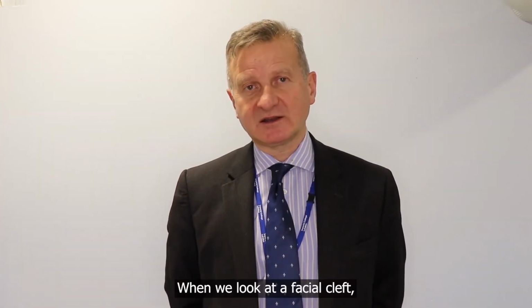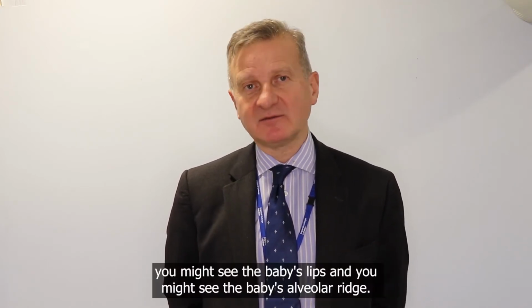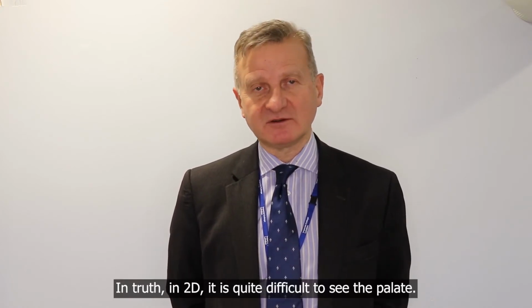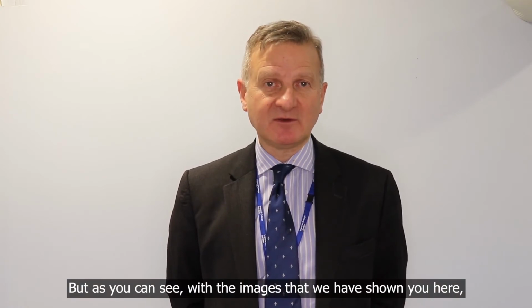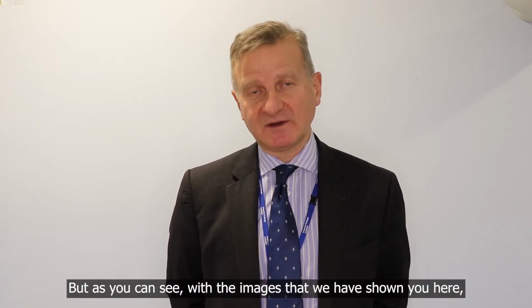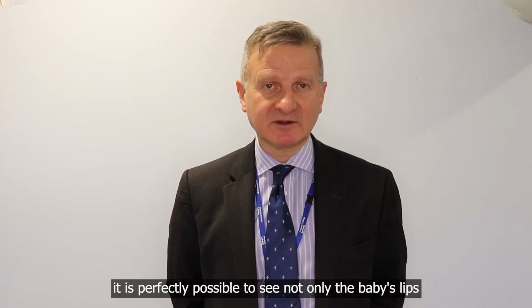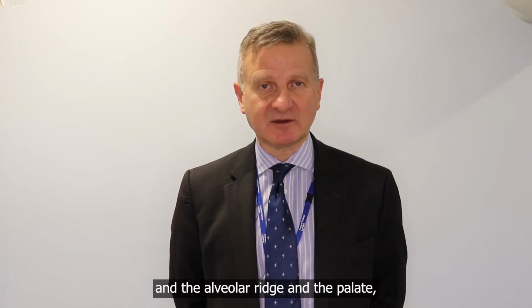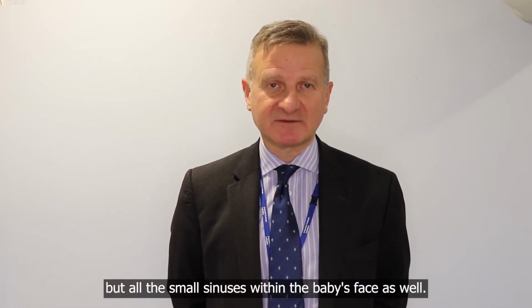When we look at a facial cleft, when you use conventional 2D ultrasound, you might see the baby's lips and you might see the baby's alveolar ridge. In truth, in 2D it's quite difficult to see the palate. But as you can see with the images that we've shown you here in respect to the fetal palate, it's perfectly possible to see not only the baby's lips, the alveolar ridge and the palate, but all the small sinuses within the baby's face as well.